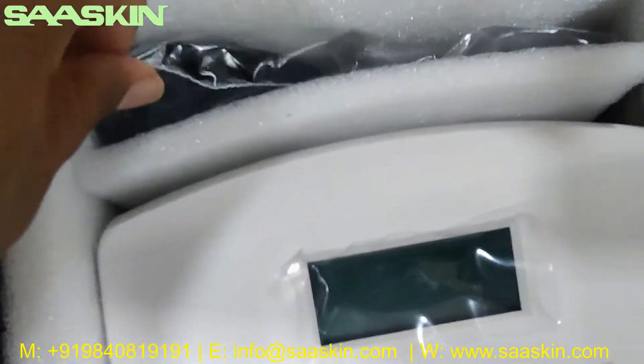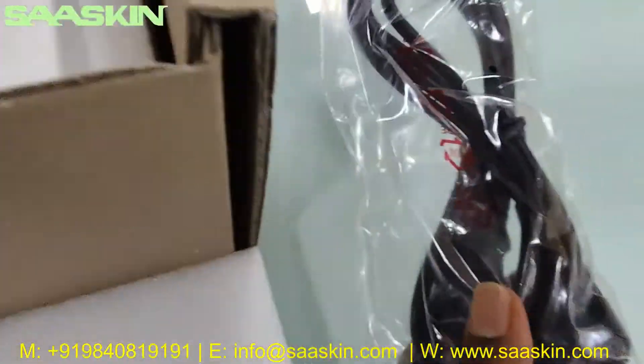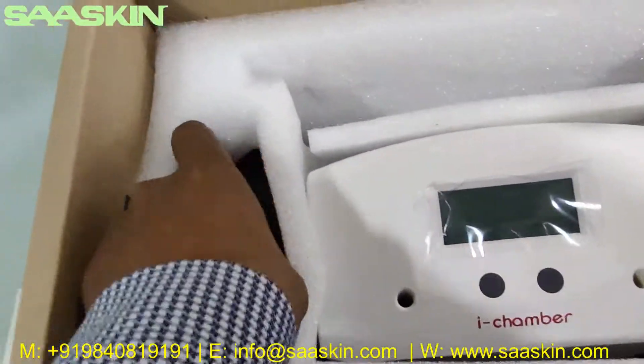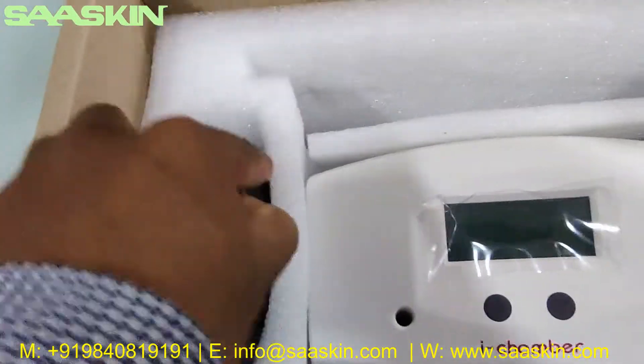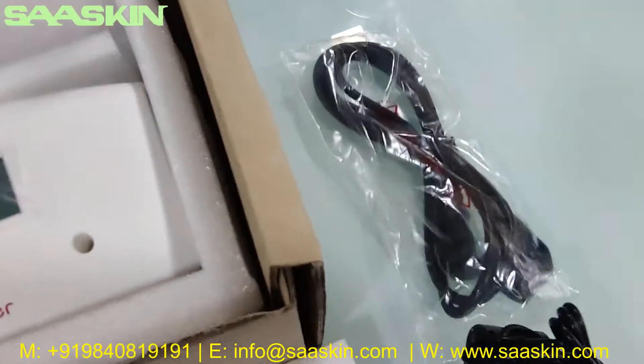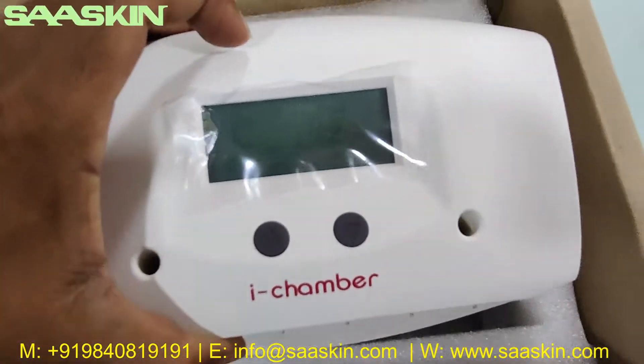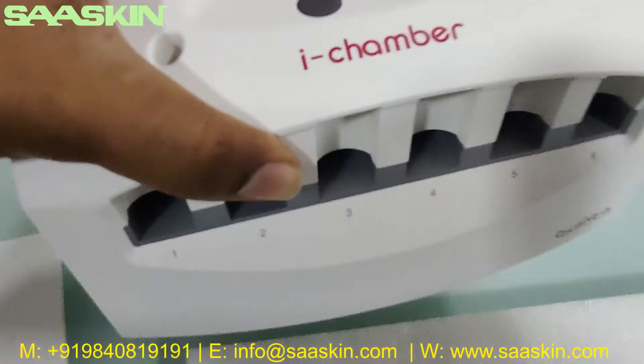And there is one cable, and also there is a power adapter. Let's take this power adapter out. And this is the machine — okay, let me take this machine out, you can see the machine.